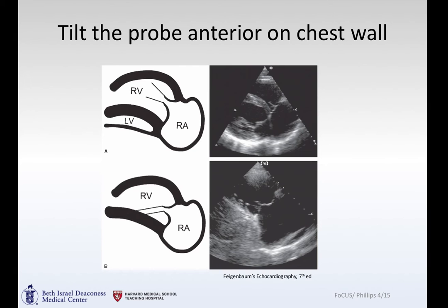As an excursion from what we were doing last time: when you're on the parasternal long axis view, you can tilt your probe down — bringing the tail down towards the left shoulder. As you do that, your scanning fan moves more anterior and you open up the right ventricle and right atrium. Tipping even further, you completely lose the left ventricle and you're now fully anterior with your right atrium, right ventricle, and tricuspid valve.